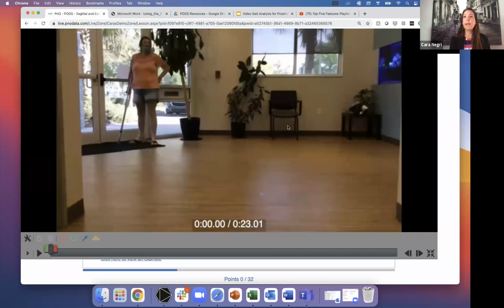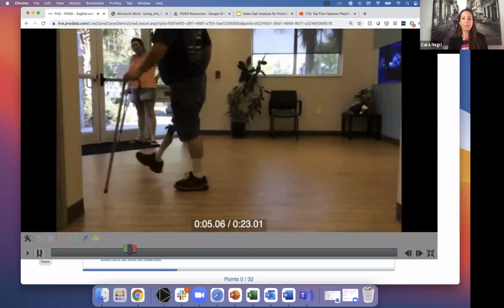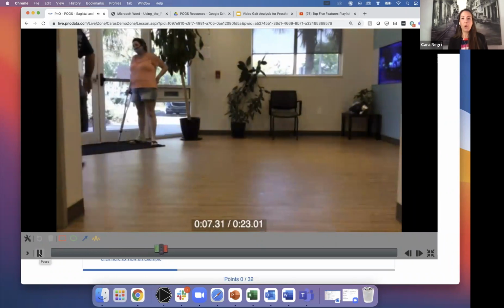I didn't see your question, Rachel, but I'm glad I already answered it. So we're going to watch this patient here. And this is going to pull up the part of the score that I'm interested in. I always like to watch them walk one way and then walk the other way as well.